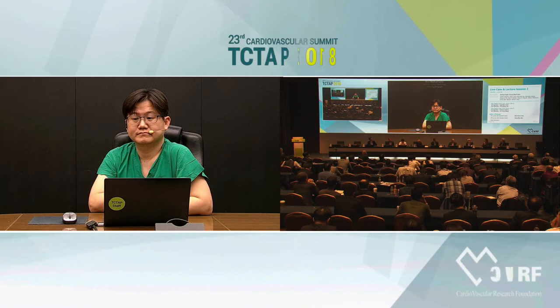First of all, the most important thing is that FFR or IFR is not to find whether ischemia is there or not. There is small to large ischemia. So the lower value of FFR or IFR means the larger ischemia. At which point we should treat it or not depends on many other factors.